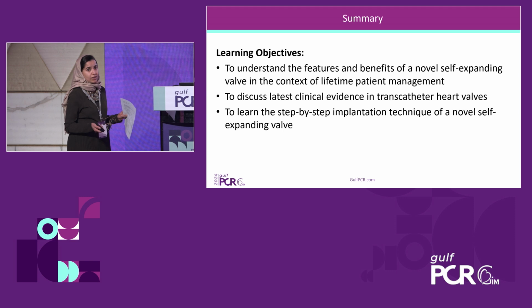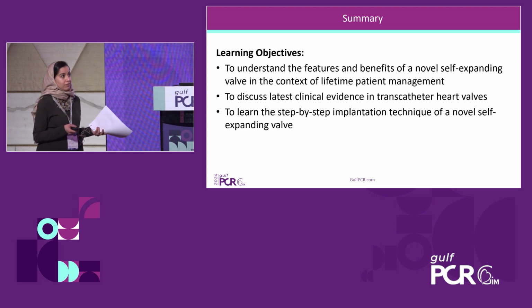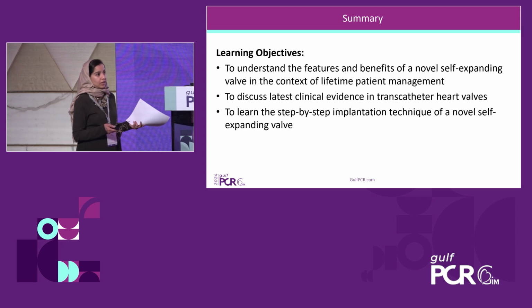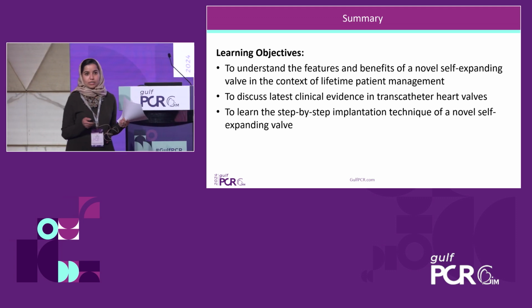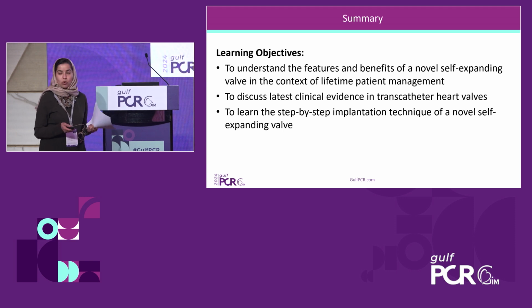So in summary, in the last hour, we talked about the features of ACURATE neo2 in terms of lifetime management. We talked about the old and most recent data, and Dr. Sayed gave us a good step-by-step implantation with the recorded case.